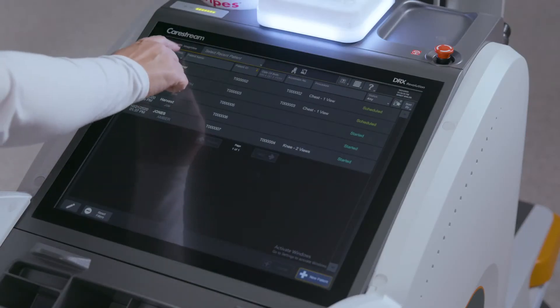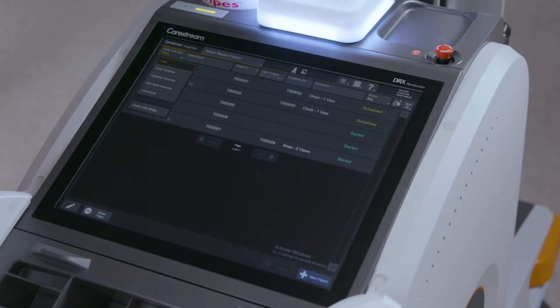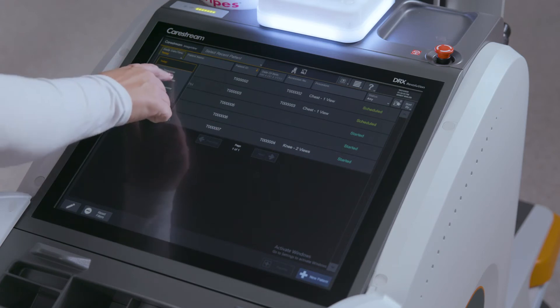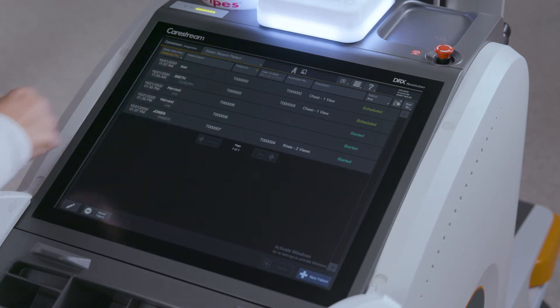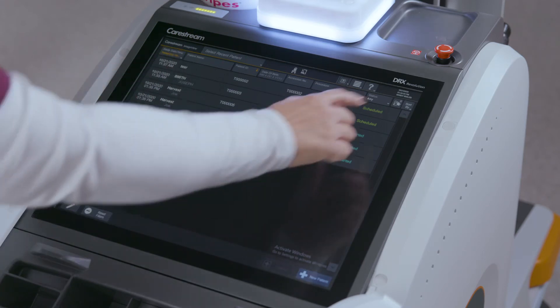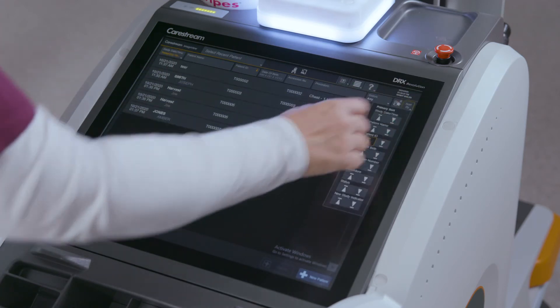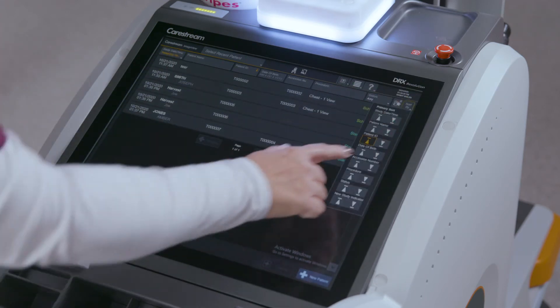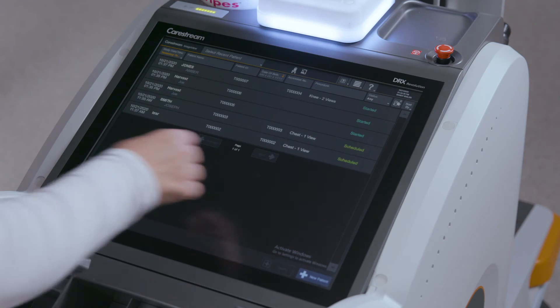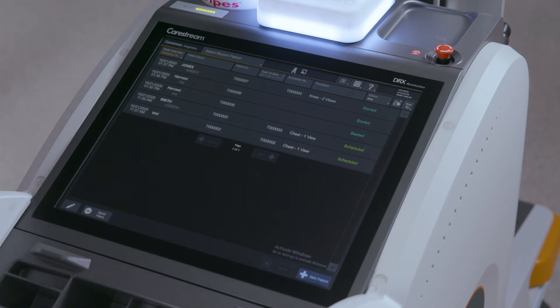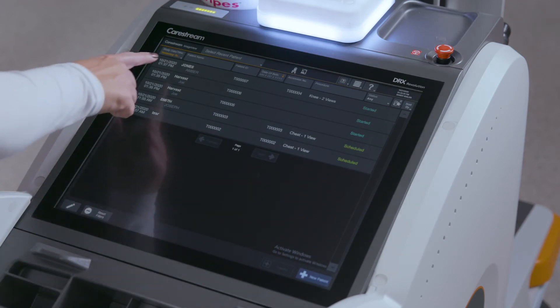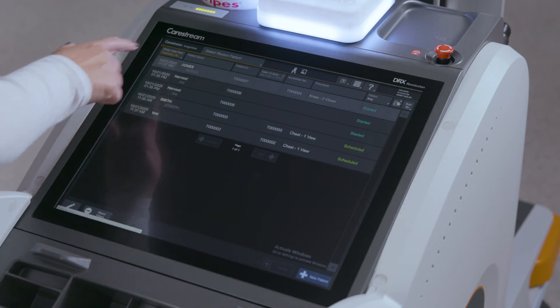Patients and exams can be added manually or selected from those populated through a HIS-RIS system. Patient information fields can be sorted by clicking on them. Clicking on the patient will start the exam.